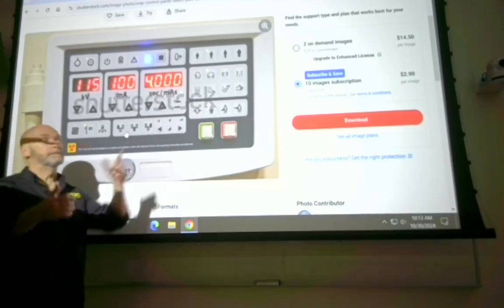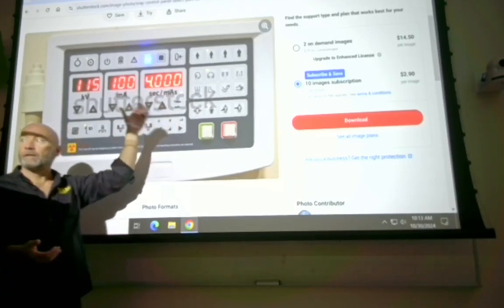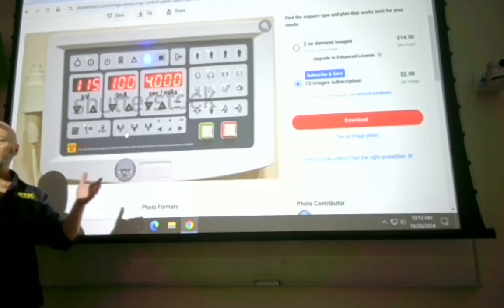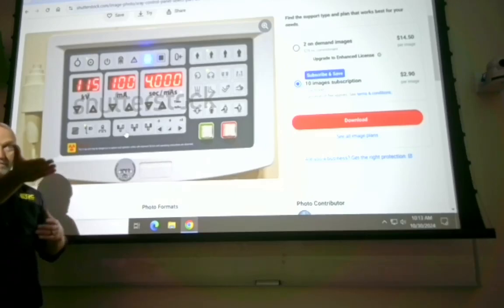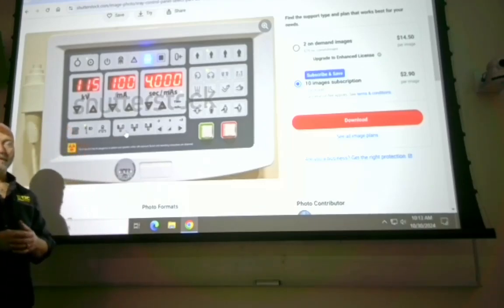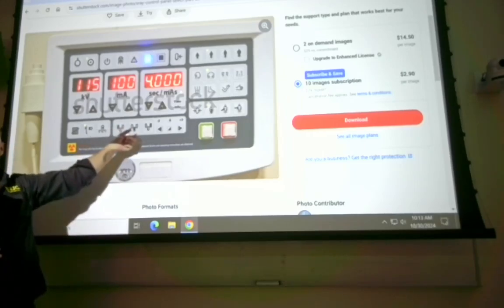MA is what you're going to have, and time is going to be determined by the photocell. But what specifically, I'm going to give this away just in the wording of this, what specifically should you have positioned over the photocell? The anatomy of interest. So when you're phototiming, what is the most important thing? Positioning. Yeah, you have to position accurately in order for these things to work right.